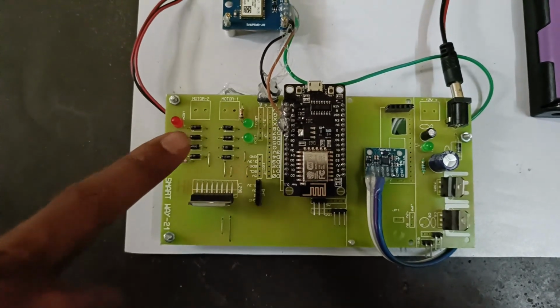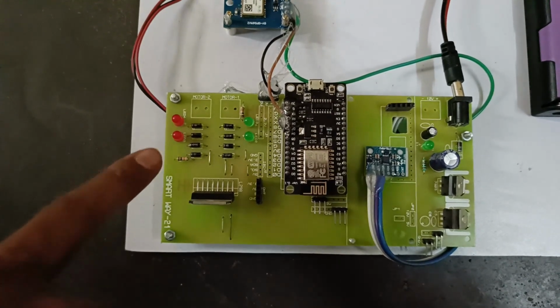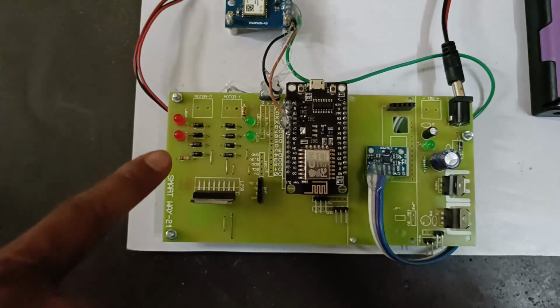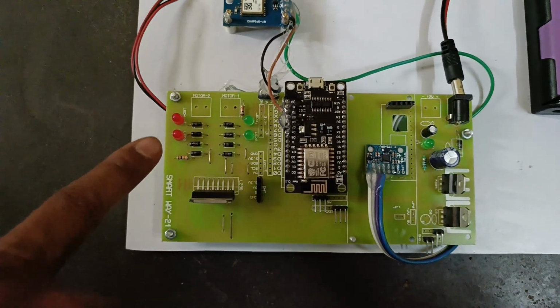Whenever the data is 2, the wheelchair moves forward, and whenever the data is valued as 3, meaning the user's head is turned right, the data will be valued as 3.